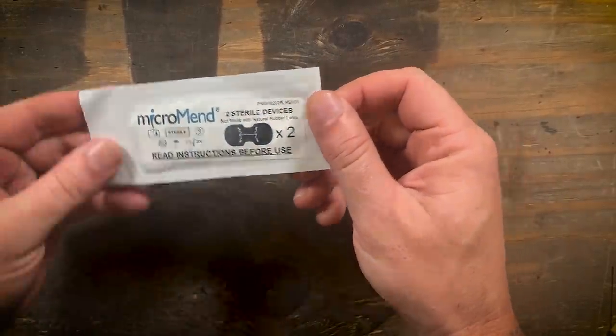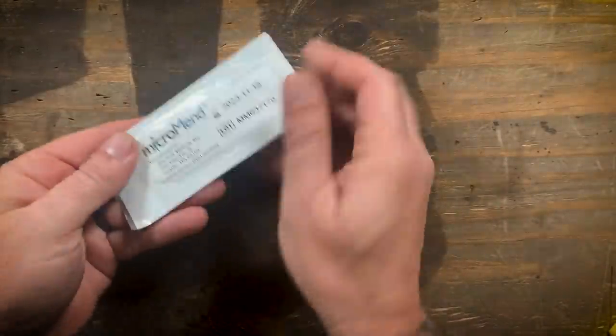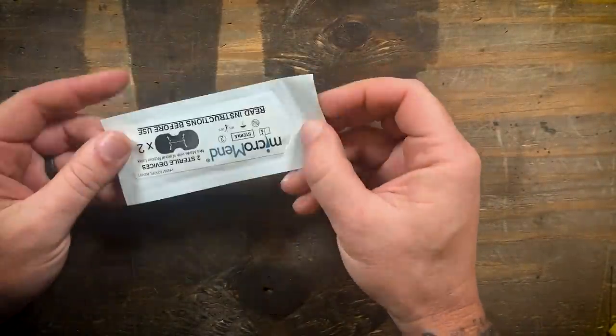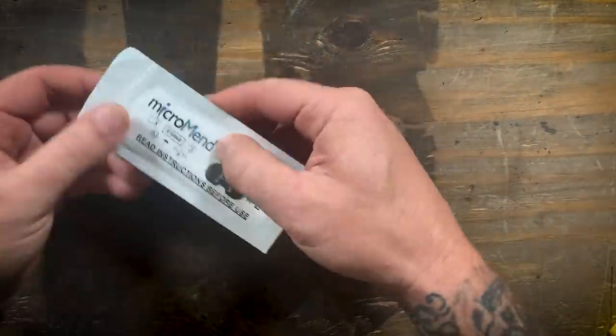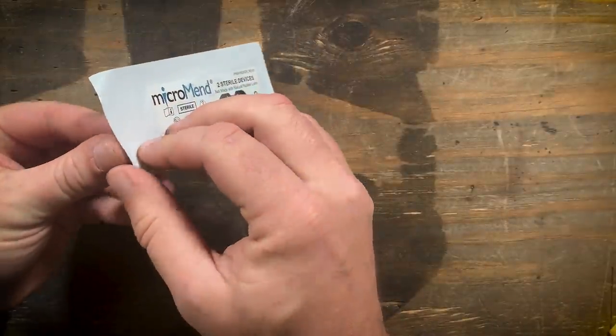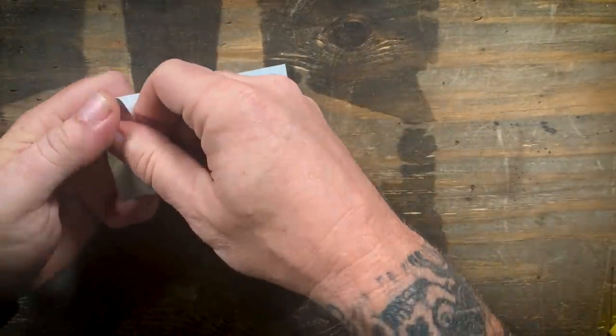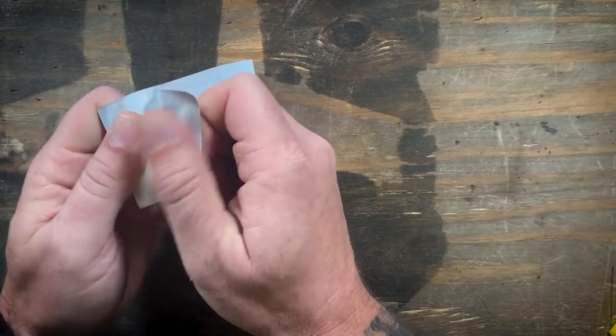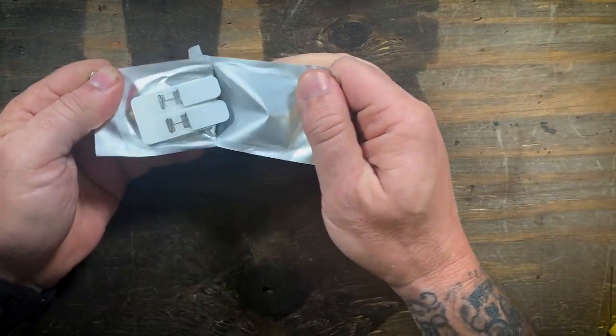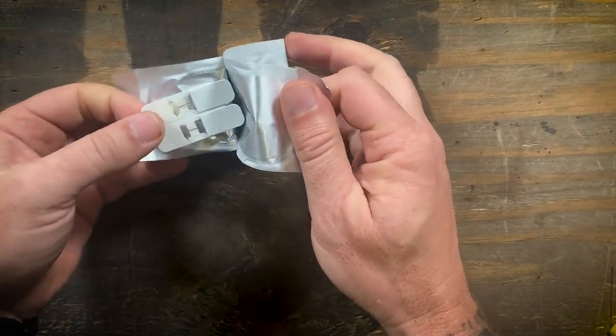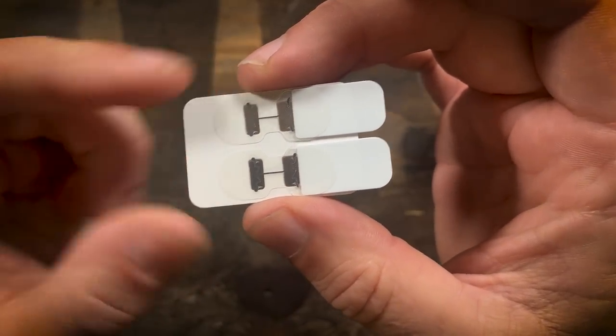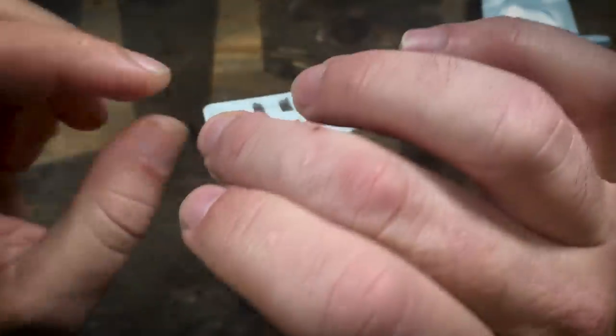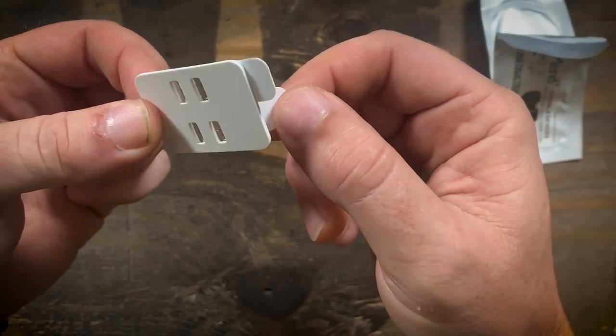So this is the Micromend, it's a really cool little flat easy to carry thing, be great to add to medical kits and it's in this sterile pouch or container. If you open this up there's two in there. So there's two sterile wound closure devices on this, it's kind of like a rubbery little pad right here and then you've got these tabs here.